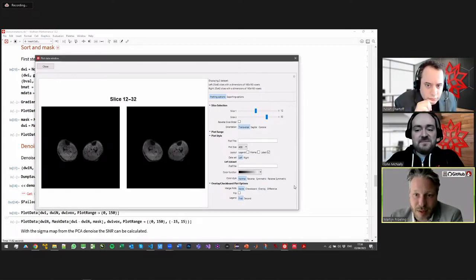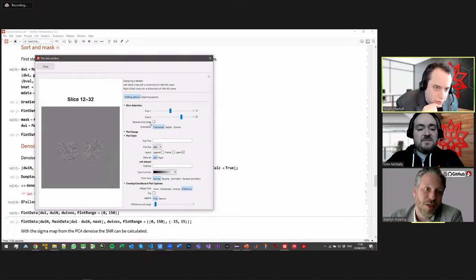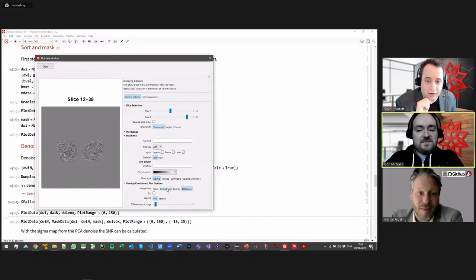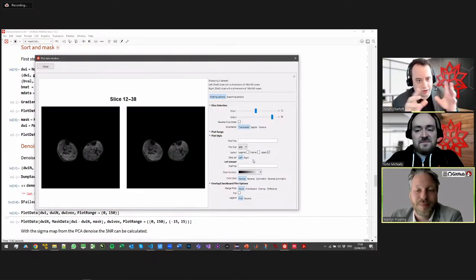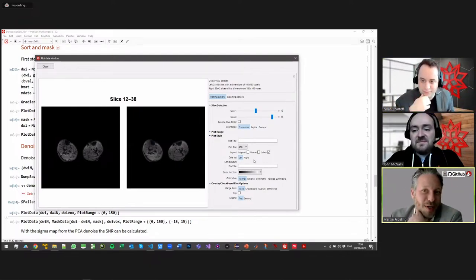Yeah. So let's look at the difference of the two. There are also some overlay things I have here. So the difference of these two data sets is immediately subtracted. We can scroll to different volumes and you see that the thing that's removed is actually noise, or actually the difference between the two data sets looks like white noise, which is good, because that's basically what it is. Yeah, it should be, if everything goes right. I see. So if you were seeing a structure that looks like muscles or something, you would say, oh, I'm removing signal and not noise.